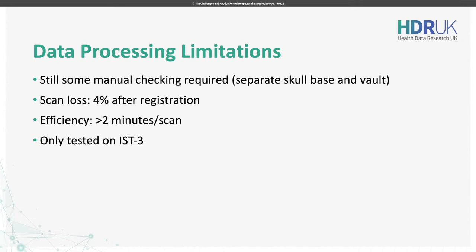And for efficiency, it can vary quite a lot. Sometimes we get results as quickly as maybe two or three minutes. Sometimes it can be longer, depending on how complex the scan is. So far we have only tested on IST3 data, and we haven't tested on other datasets. So this is the data processing stage.